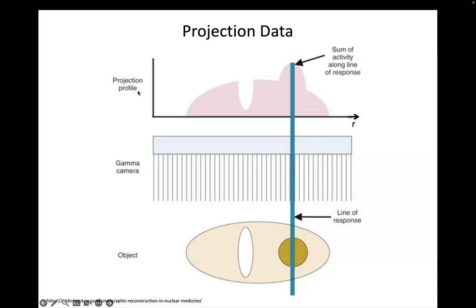When I look at what we call here a projection profile, that P of R theta function, this is for one angle, we get a high value. And then when we move across the phantom here, we get sort of a background value. And then when we move our line to go through this void where there's no sample or there's no contrast agent, we get a dip in activity. So this function is our projection that we're going to use to create our image of the object.